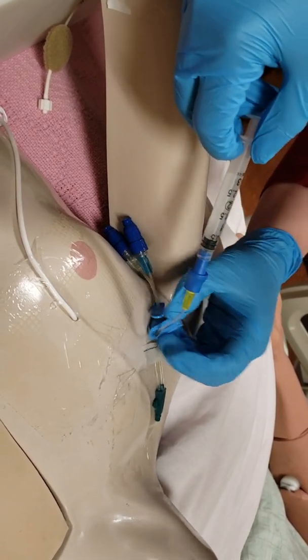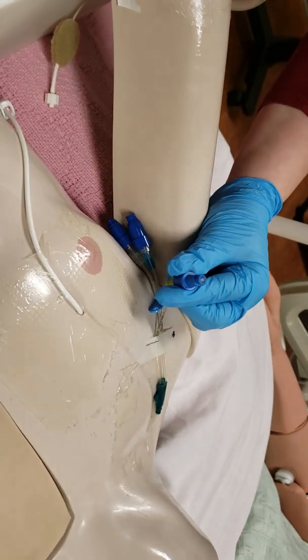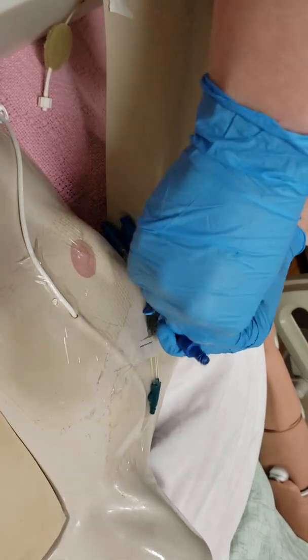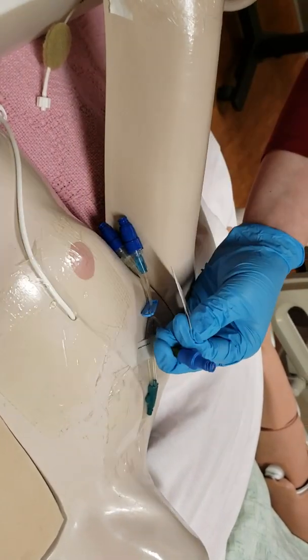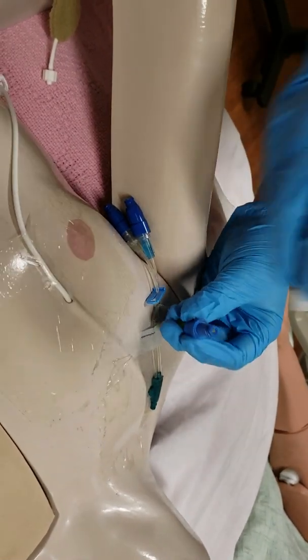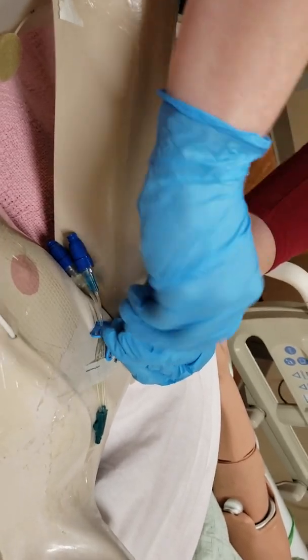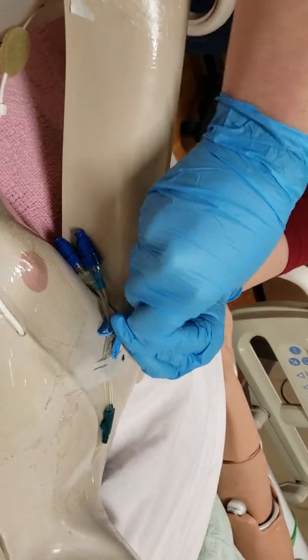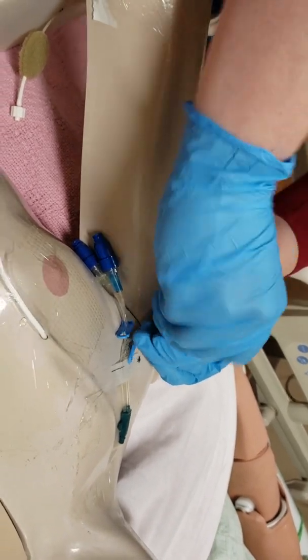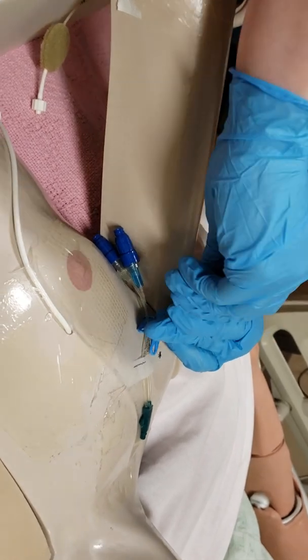I am going to clamp, remove my medication, okay. I'm going to clean one final time. Now this time I can be looking at Mary and just assessing, is there any respiratory distress? Do I see any kind of reaction happening?